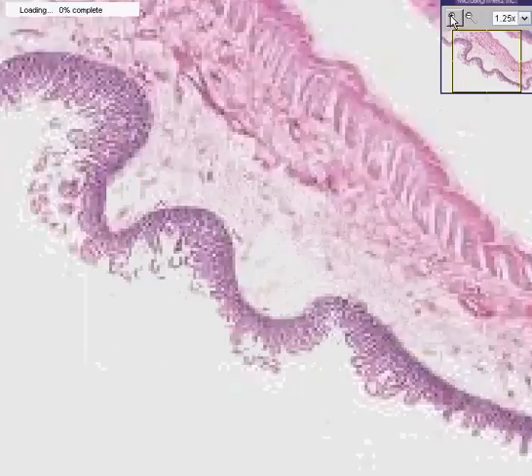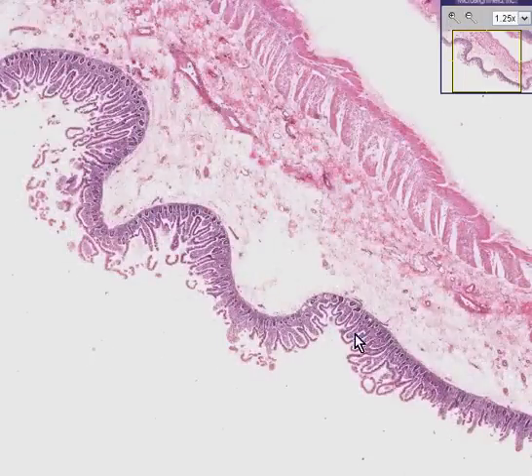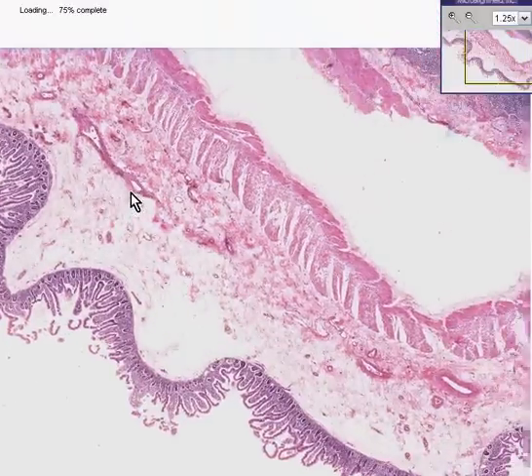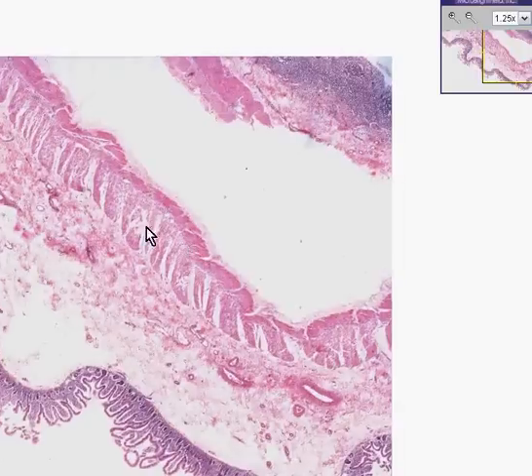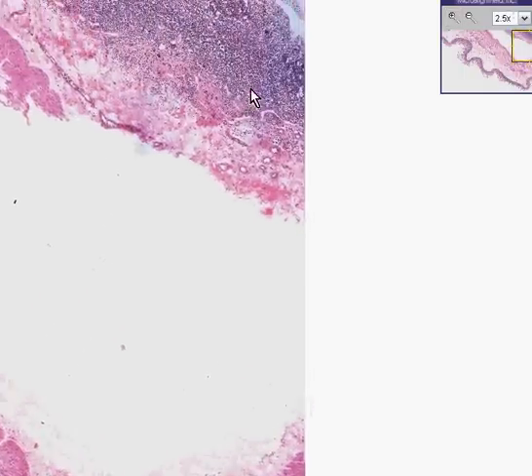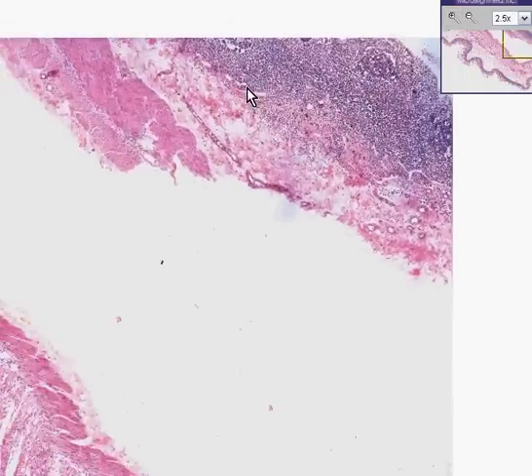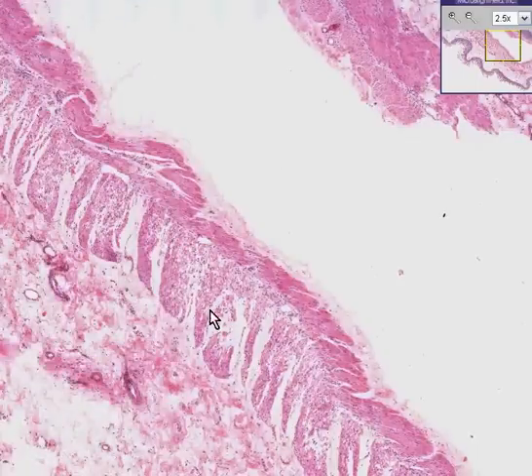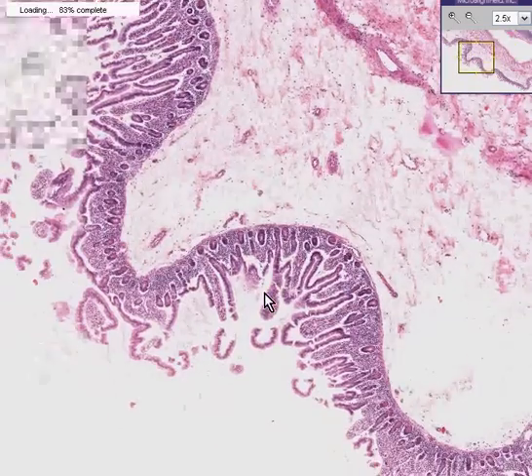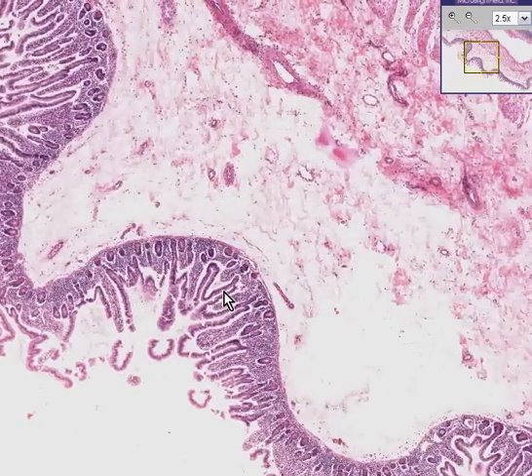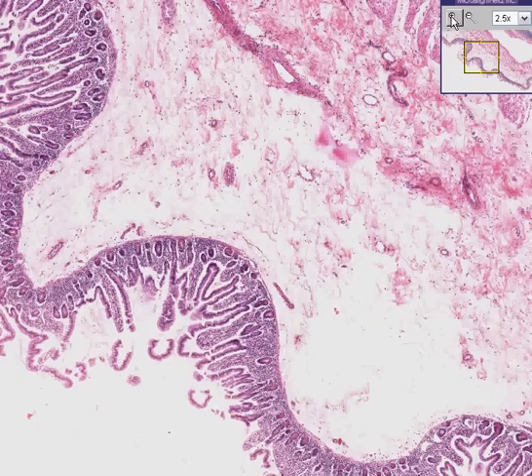You can very clearly see a papillary mucosal pattern, a lot of very edematous submucosa, smooth muscle within the wall of this organ, and even out here, even though there are some infiltrates of chronic inflammatory cells or lymphoid tissue beyond the muscular layer within the serosa. We can recognize this as being bowel. There are some circular muscle layers, some longitudinal muscle layers, here's the mucosa, here are the villi. Because we are calling this villi, and the fact that we have the full length of outer longitudinal muscle, we know that this has to be small bowel rather than large bowel.